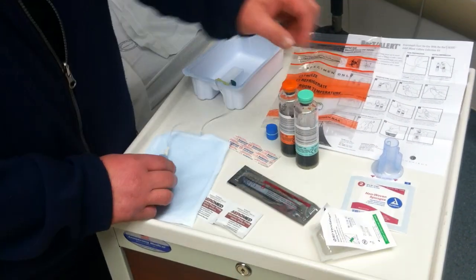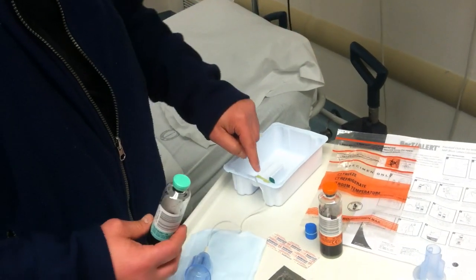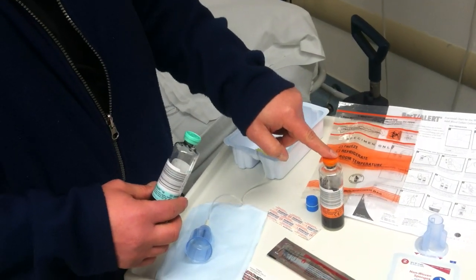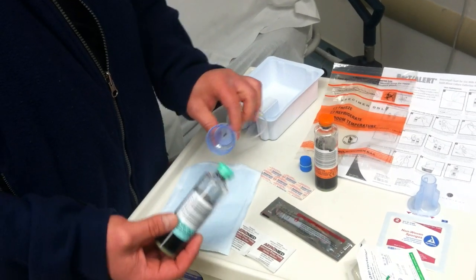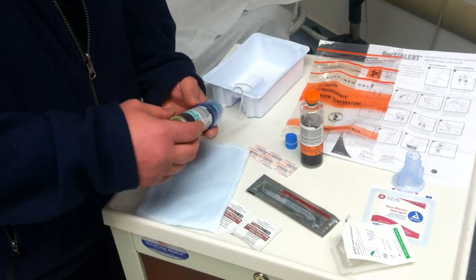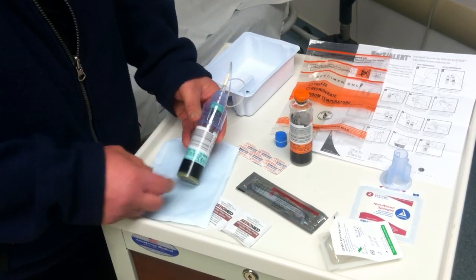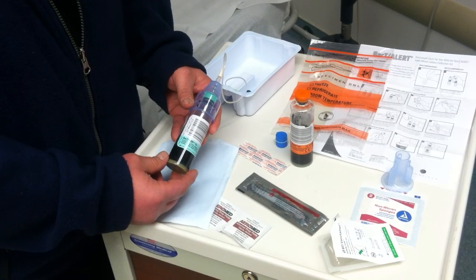The first culture to be drawn should be the aerobic culture, because we do have air in the line and we do not want to contaminate the anaerobic culture with any additional air. Once it's set, the bottle simply goes in, we puncture, and we don't want to tip the solution to prevent any backflow. We fill the bottle with at least 5 mLs of sample.